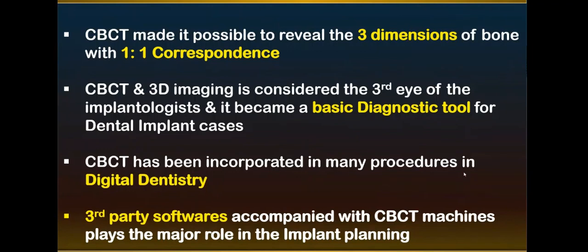CBCT is also incorporated in many procedures in digital dentistry. This means that CBCT can be integrated with CAD/CAM, photography, or facial scanning. A lot of techniques can be incorporated with CBCT.